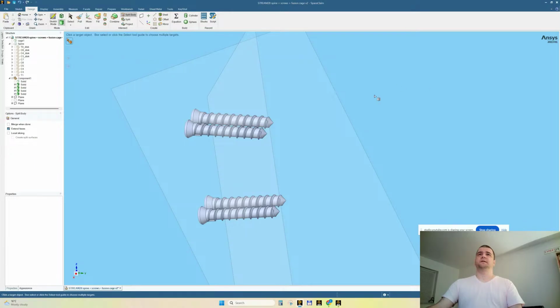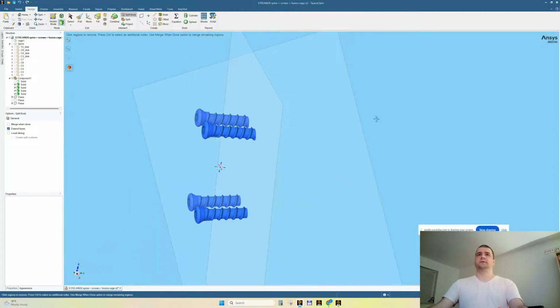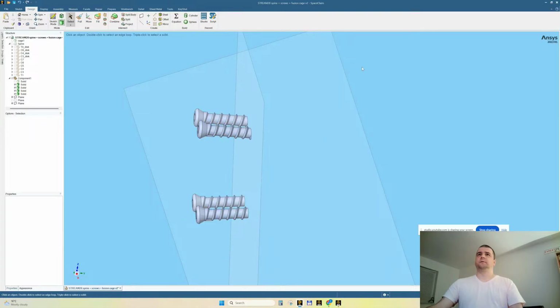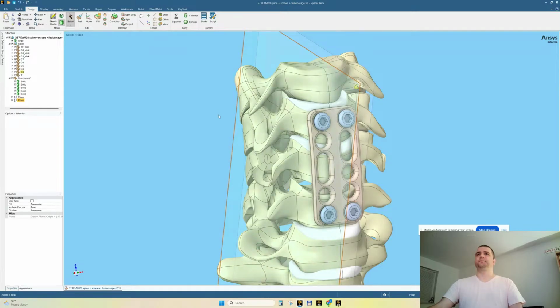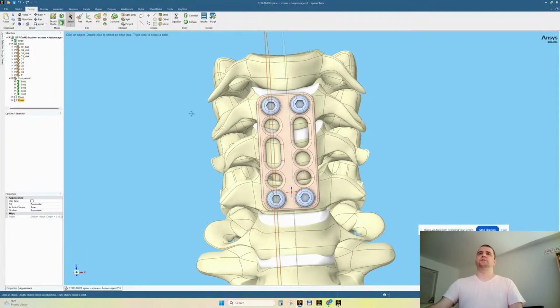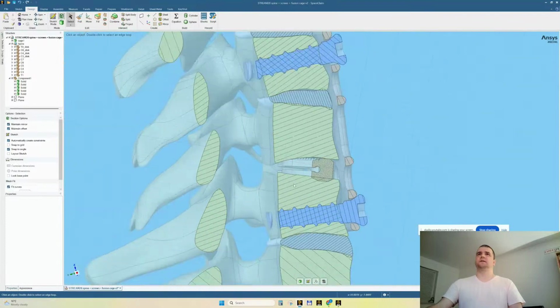So let's split the bodies. Click a target. This is a target. With control pressed, we have more targets. Done. We release control. Click a face plane, whatever. We don't need this. I can delete this plane. And let's look in the section view. I'm clicking this plane which goes through the screws. Section mode. Yes, we're very nice. A little outside, a little inside, it's perfect.